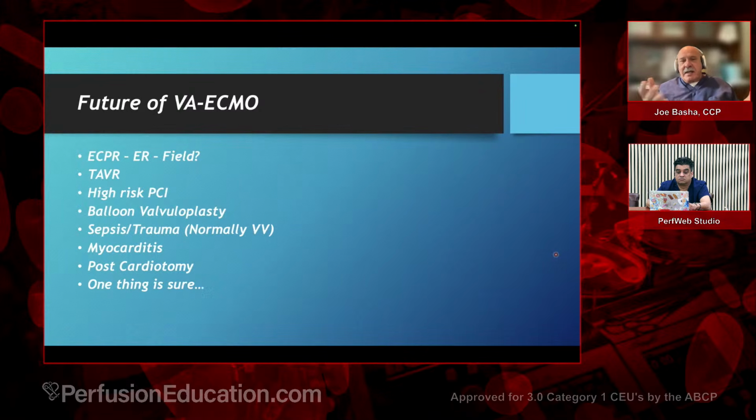What's the future? I think ECPR is here to stay, doing this in the ER. Will it happen in the field in America? I don't know. For TAVR, we are doing it a lot. TAVR support is making it much easier to do these procedures. If the patient becomes unstable, they don't have to rush, they can take their time and figure things out.